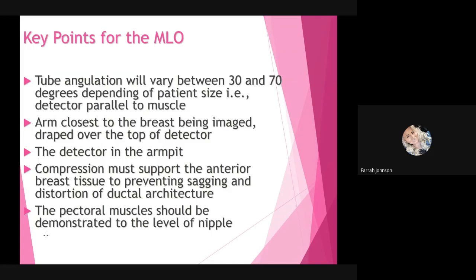And the pectoral muscle should be demonstrated to the level of the nipple. If you do not see pectoral muscle directly posterior to your PNL, then you did not include enough of your breast tissue on that MLO.